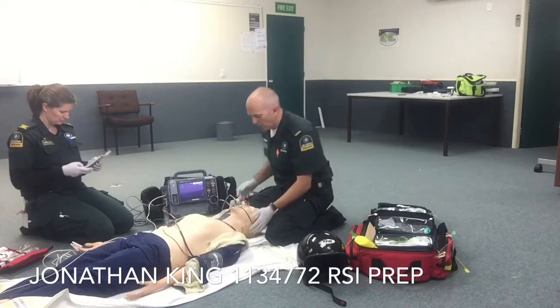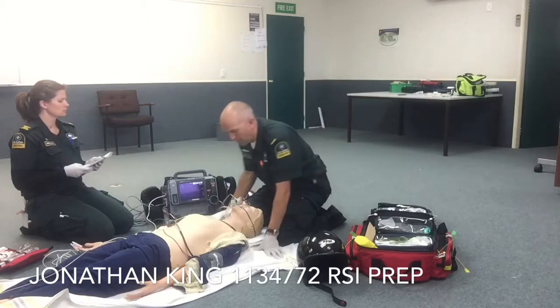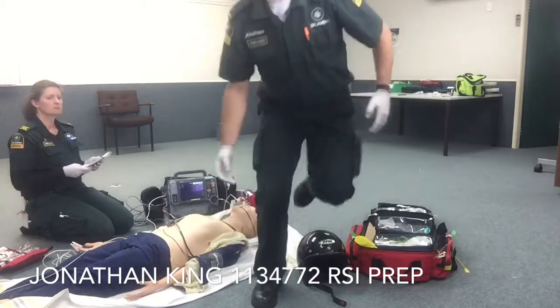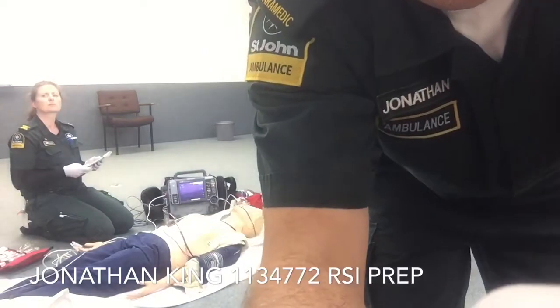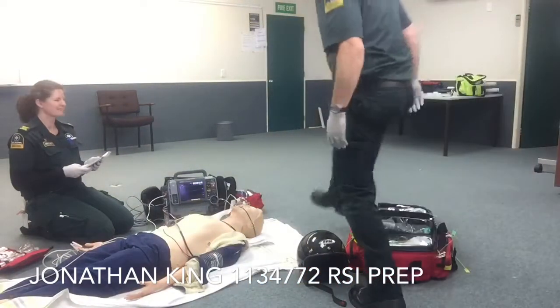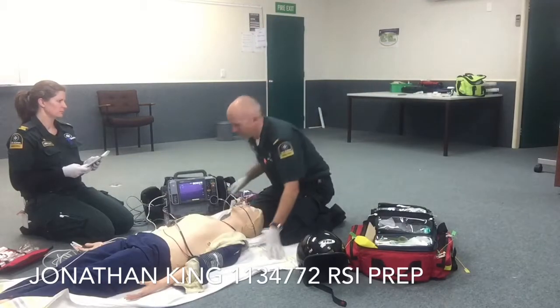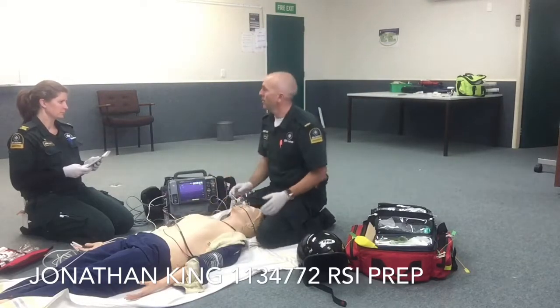Okay. So he's got his own respiratory effort. We do have the reservoir mask on. Bag mask is at the ready with PEEP set to 5.